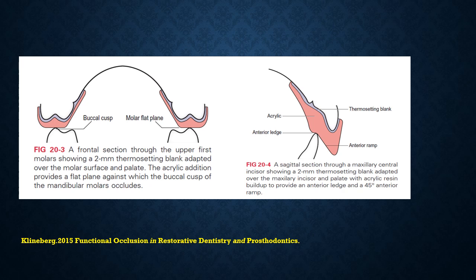Also a 45-degree anterior ramp is created to help you guide the patient in the eccentric jaw relations.